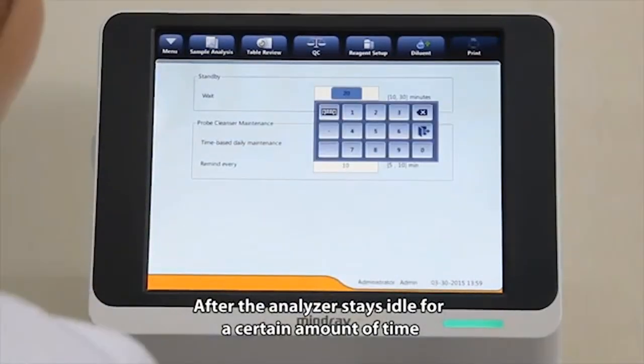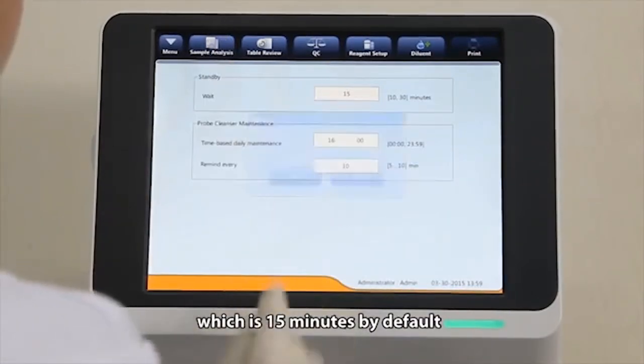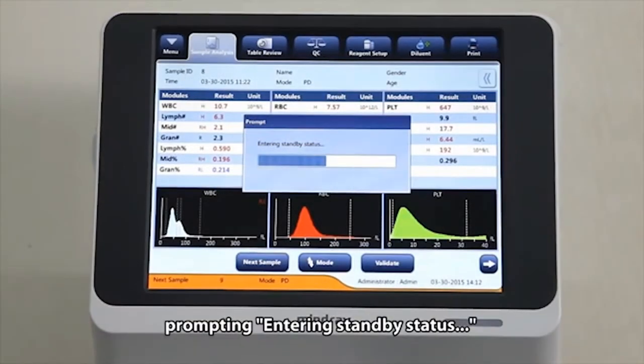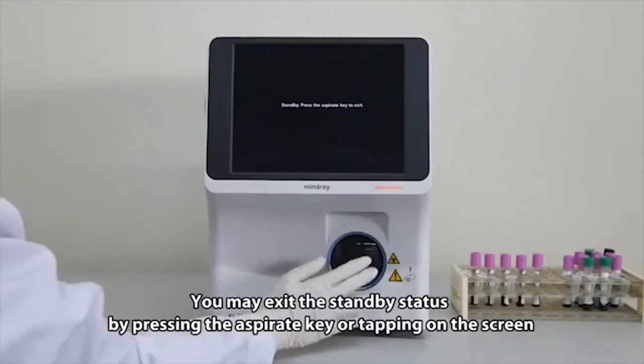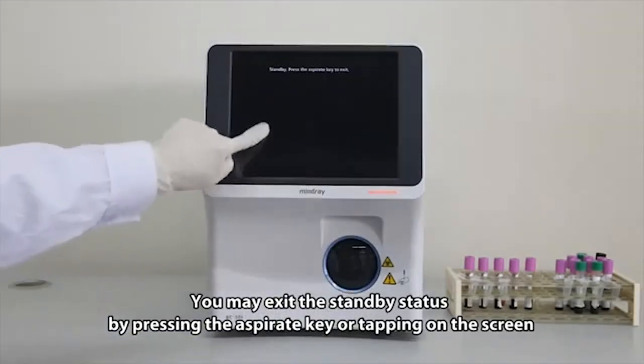After the analyzer stays idle for a certain amount of time, which is 15 minutes by default, a dialog box will pop up, prompting entering standby status. You may exit the standby status by pressing the aspirate key or tapping on the screen.